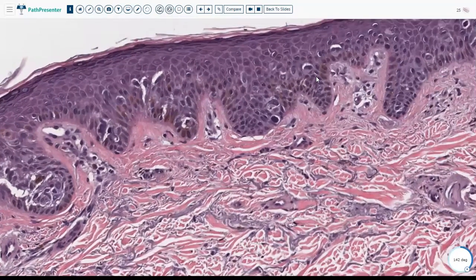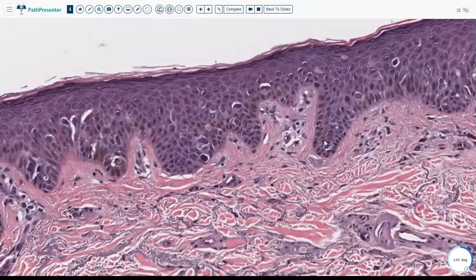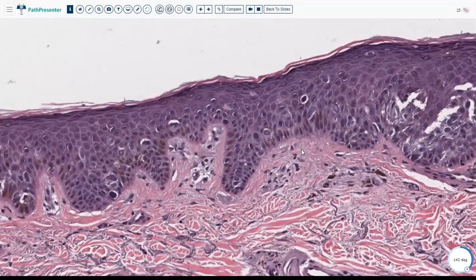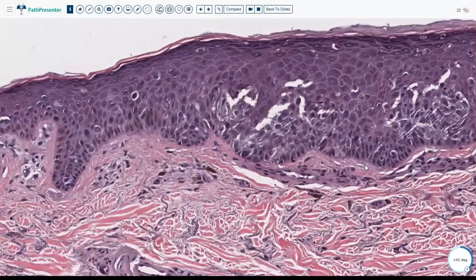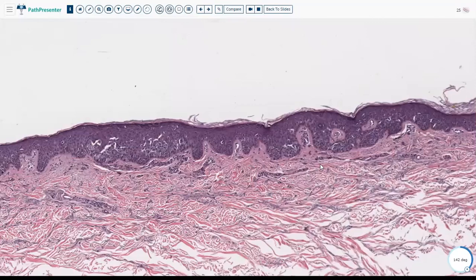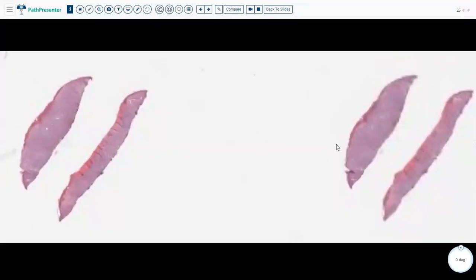Like when I explained to you in the first lecture, you can tell that this is a melanocyte, not a keratinocyte, because of the cytoplasm. Normally, if there's a cleft and you see a keratinocyte, you would not see much of a pinkish cytoplasm. You just see a blue nucleus, and the cytoplasm is clefted from the nucleus. So again, melanocytes here. You can see them all becoming pagetoid. For example, this is a keratinocyte. You can see here, dark color, and the cytoplasm is outside the cleft. So again, it's mostly single cells predominating over nests. And if there are nests, you would see irregularly shaped nests, not very well defined nests. All features of a melanoma in situ.